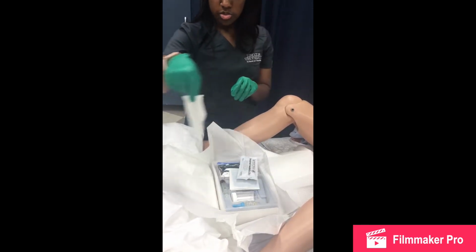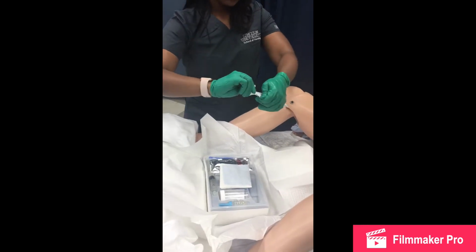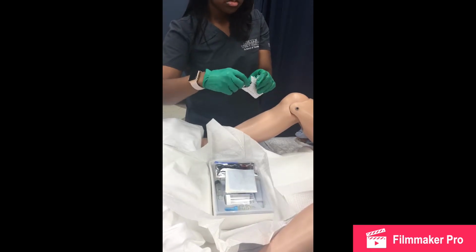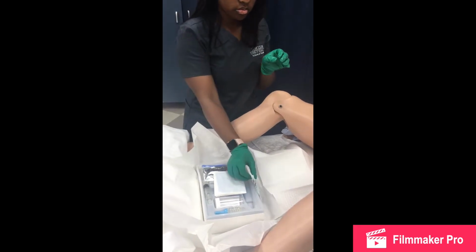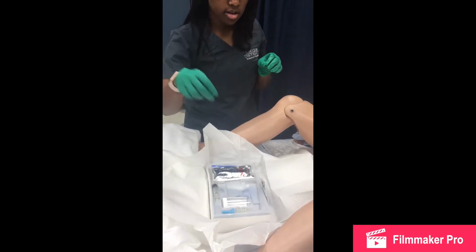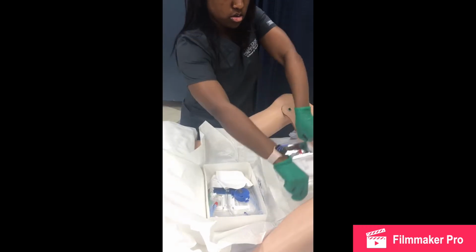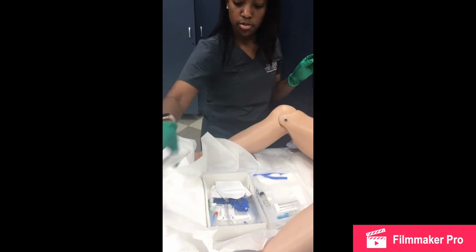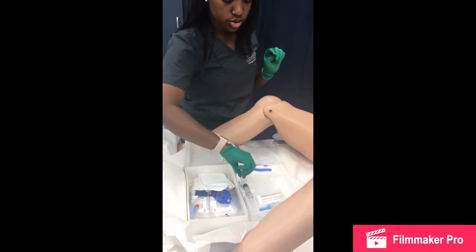I do not need this portion because this is for the male. I can open my swab sticks. These gloves did not fit, so I'm going to put those to the side. And I'm going to pick up this tray. I'm not going to use the iodine for my patient, so instead I'm going to use the swab sticks. And then I'm going to test out my catheter.